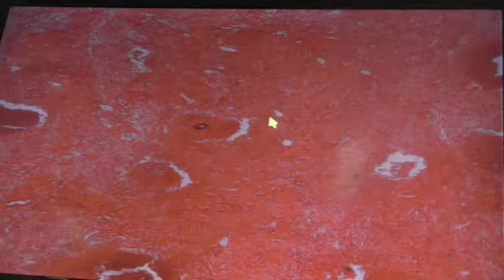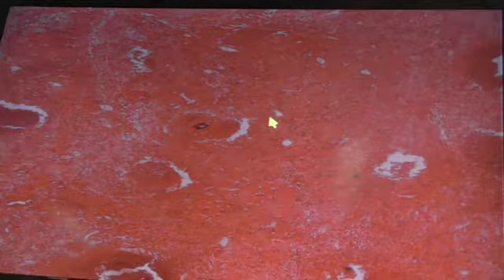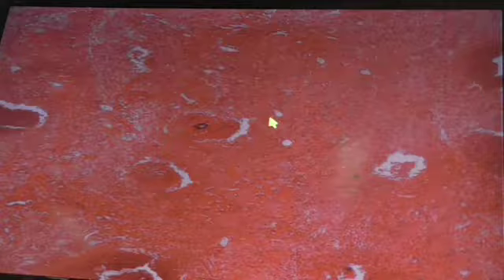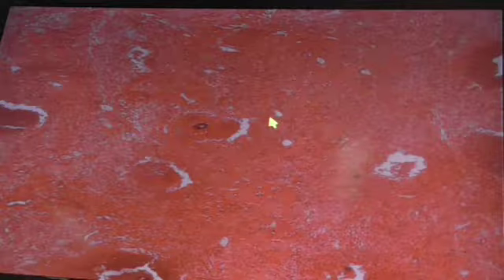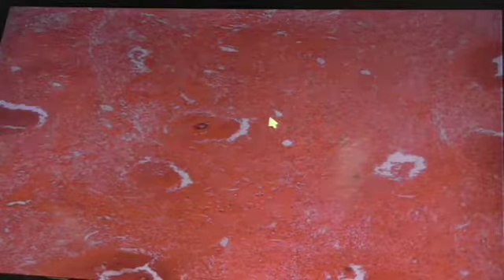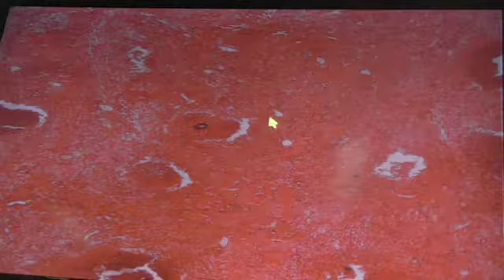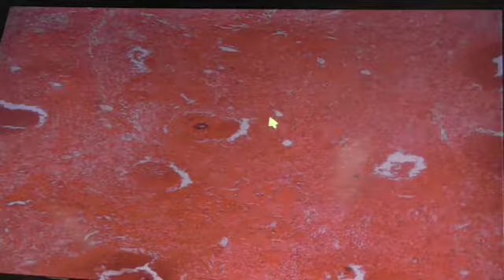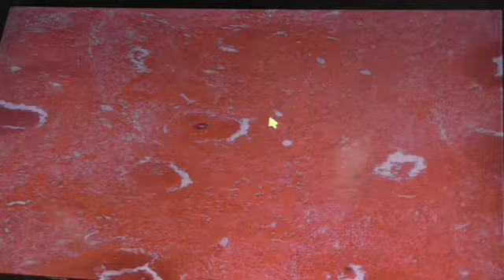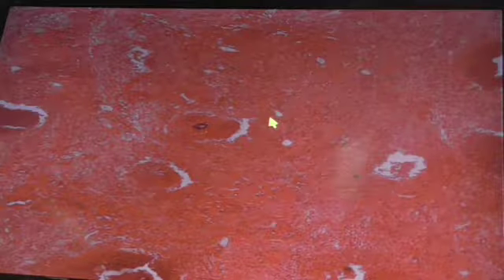I saw a lot of inflammatory cells, mixed fields. Okay. All right. Anything else over there? We saw leukocytes. Okay. What kind? Epithelial cells. Okay. All right. So epithelial cells. Anybody else see those again? What other cell types?